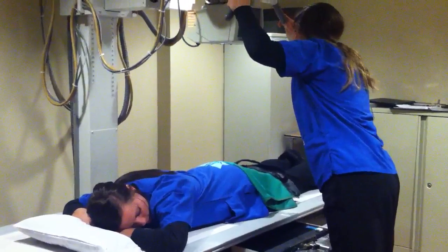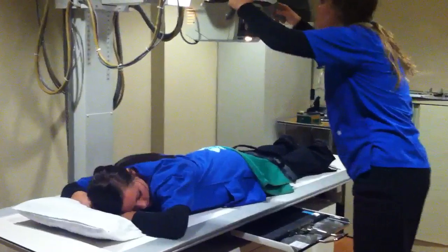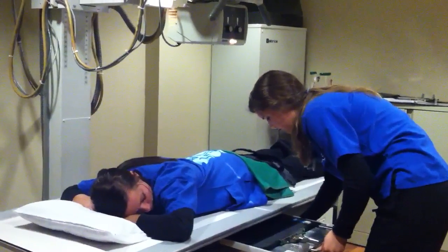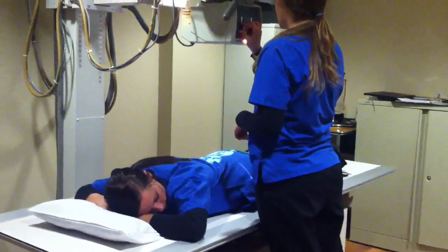And 40-inch SID. Put in there and open it up to a 14 by 17.